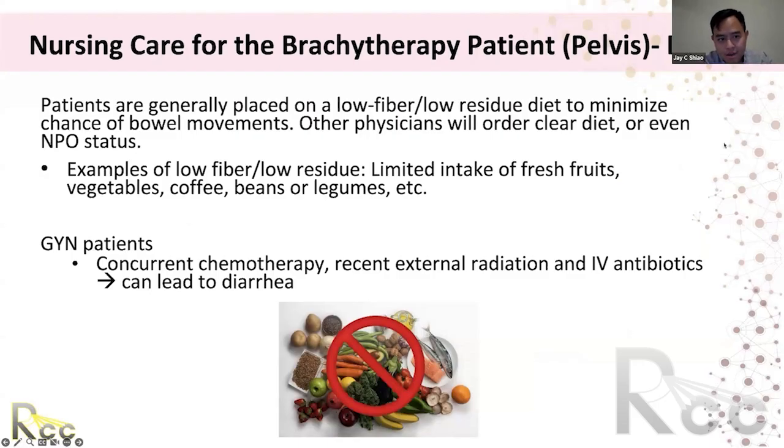What I wanted to ask here, I struggle with this for some of my patients, and I'm curious from a nursing perspective what you do. Sometimes with the more complex interstitial GYN cases that we keep overnight for a few days, it's hard because they're lying in bed in stirrups or legs separated, flat for 3 days, and we try to limit their diet because we don't want them to stool onto the applicator.